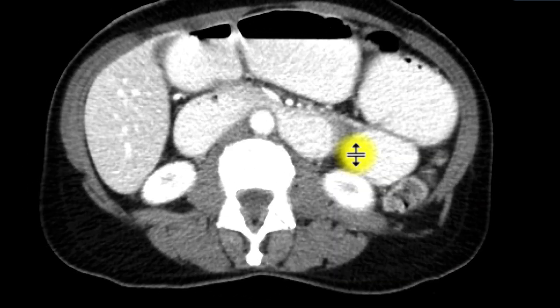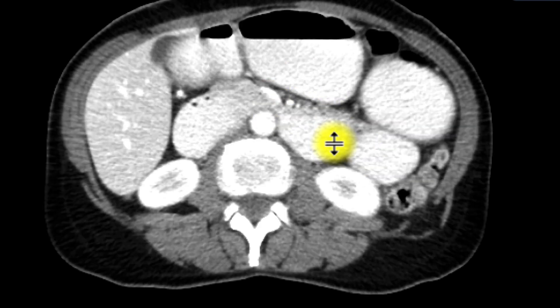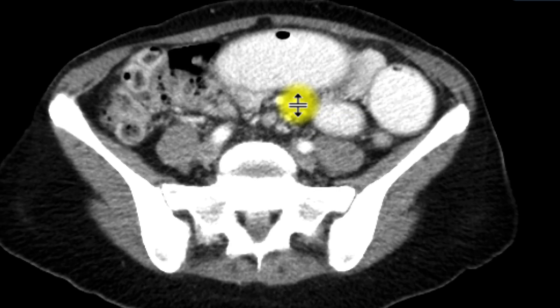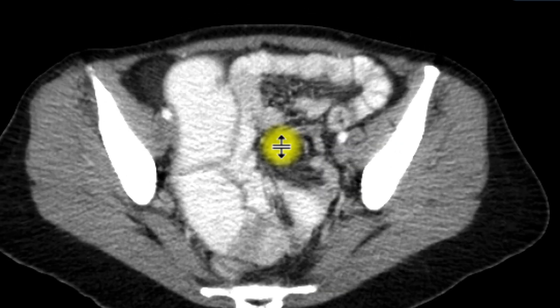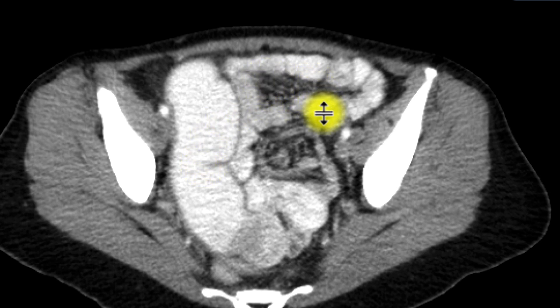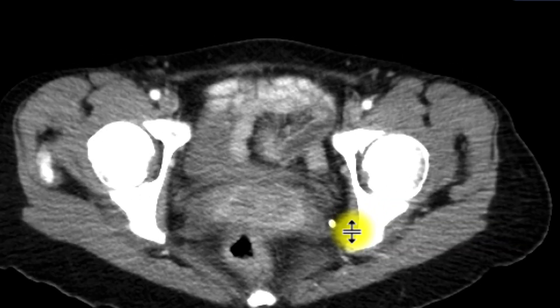Further down, we can see lots of loops of small bowel that are also distended, filled with oral contrast, and nothing in the large bowel in terms of oral contrast. As we go downwards, we're starting to see some distended loops of small bowel with oral contrast and some loops of bowel that are relatively underdistended. These small bowel loops are also filled with oral contrast.